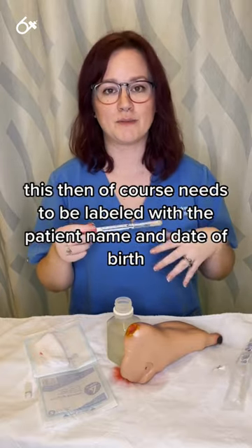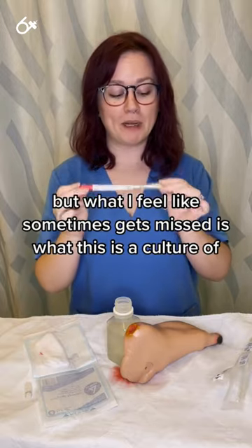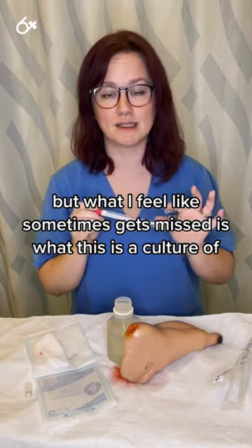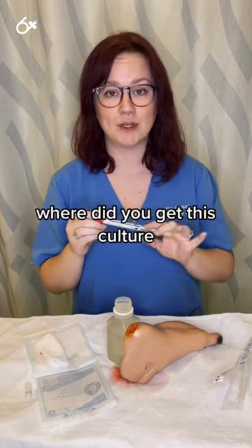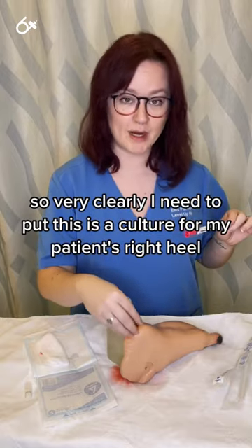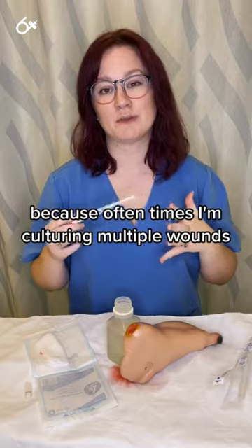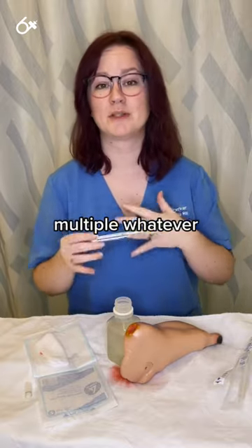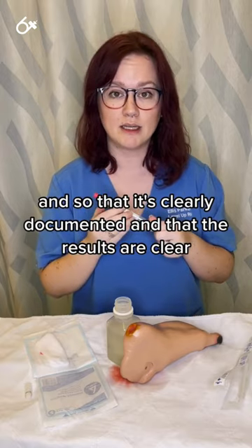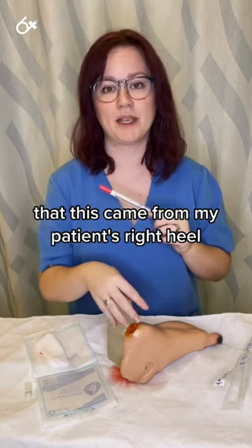This then needs to be labeled with the patient name, date of birth, and other required identifiers. But what sometimes gets missed is labeling what this is actually a culture of — where did you get this culture? Very clearly, I need to note that this is a culture from my patient's right heel, because oftentimes I'm culturing multiple wounds or multiple sites, and I want to make sure the lab knows exactly where it came from so the results are clearly documented.